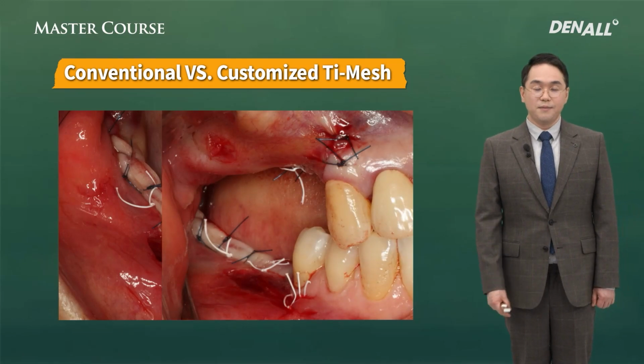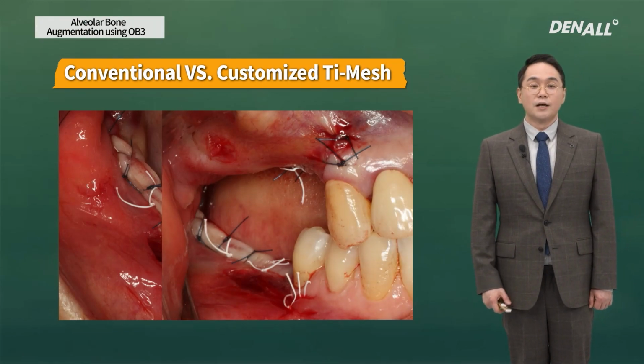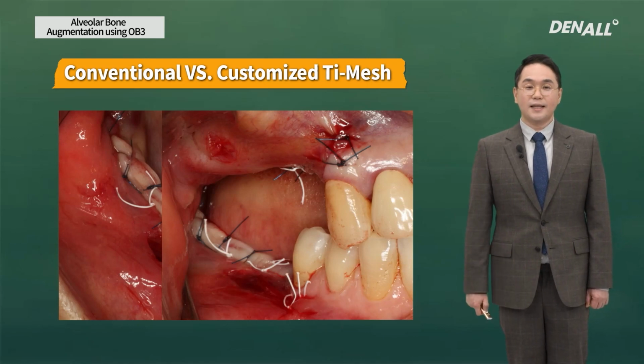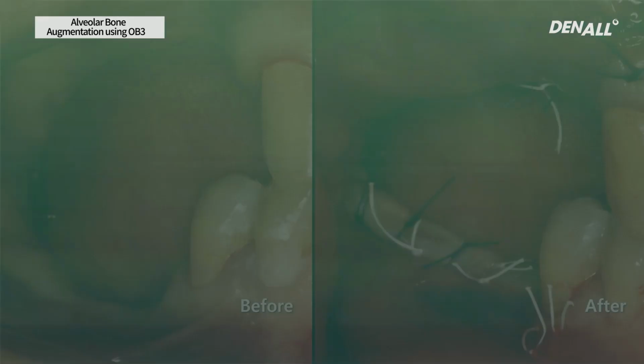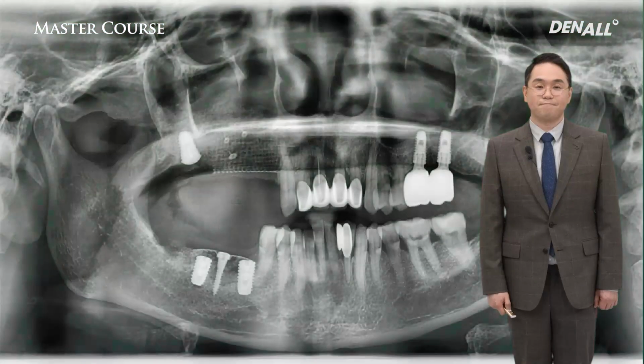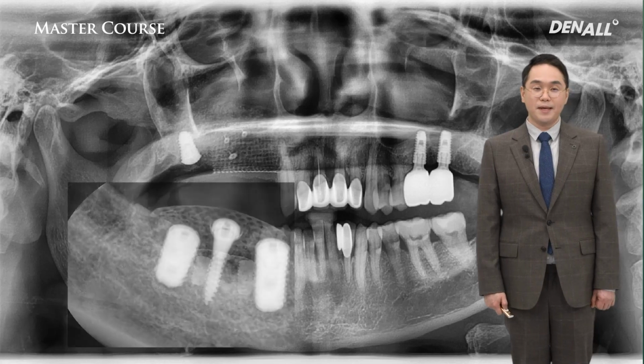After the mandibular operation, in the lateral photo, if you see it here, in both jaws, vertical alveolar bone is augmented. If you compare before and after, in both jaws, the vertical bone defect was 4 millimeters or over. The post-op photo shows that vertical bone augmentation has been achieved. Post-op panorama and PA.